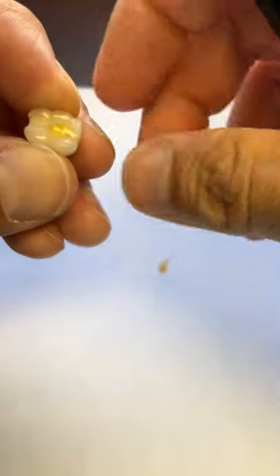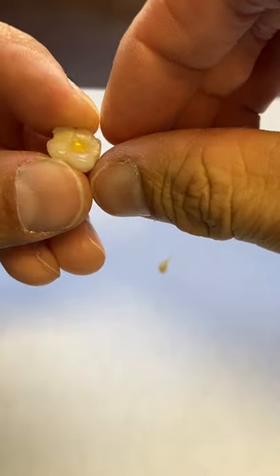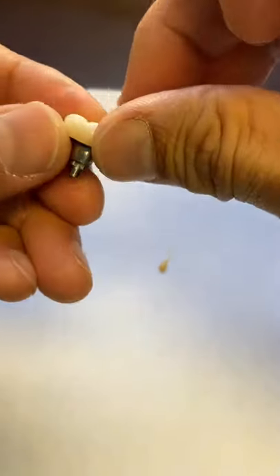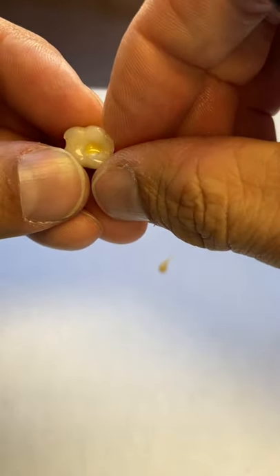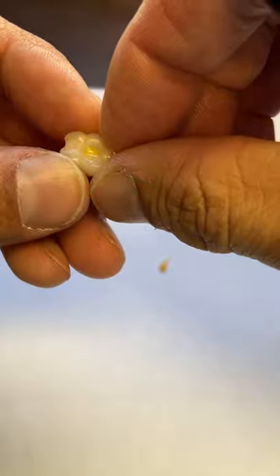Don't worry — this is an old implant crown that's not going to be used again. Interesting, eh? Let me know if you've ever used gold colored composite before. Booyah!